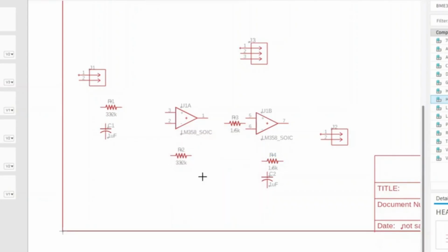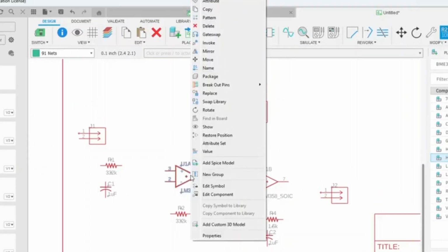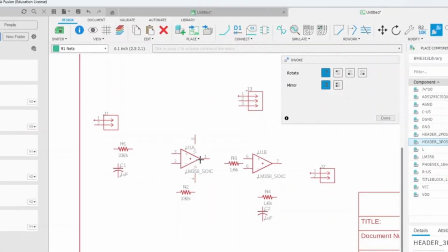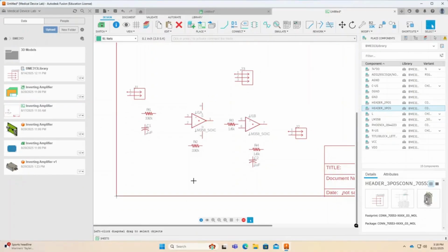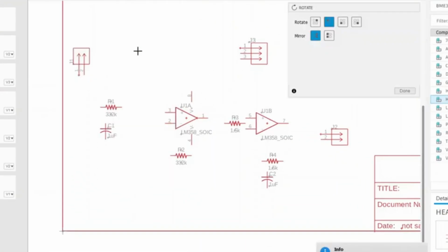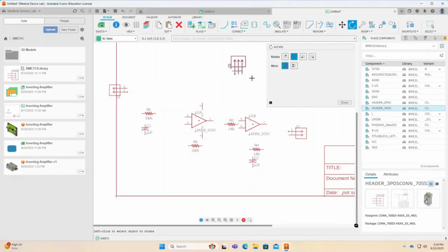Next, bring in the op-amp power pins. Right-click the op-amp, choose Invoke, and select the power pins. After that, rearrange the components for clean routing. Rotate the connectors and capacitors as needed. Right-click J1 and select Rotate. Rotate J1 180 degrees. Rotate J3, C1, and C2 90 degrees. Rearrange the components.